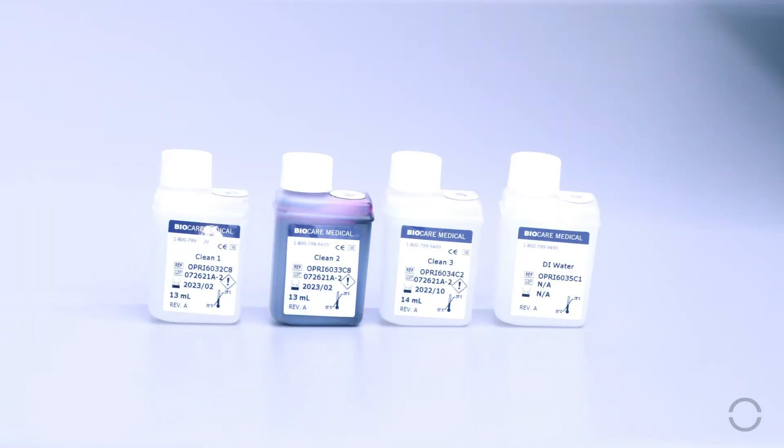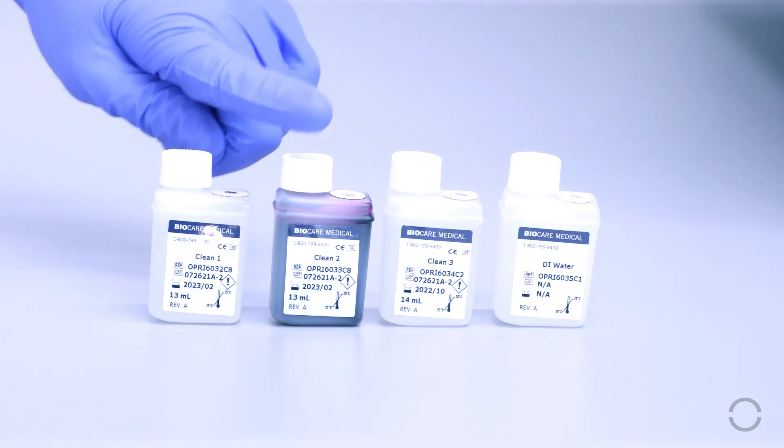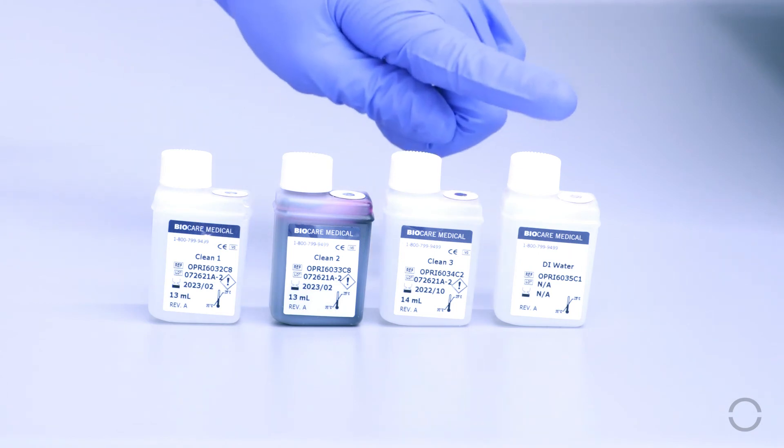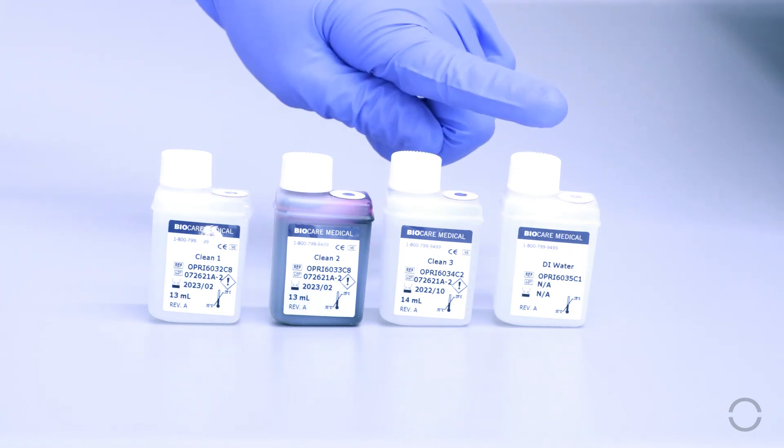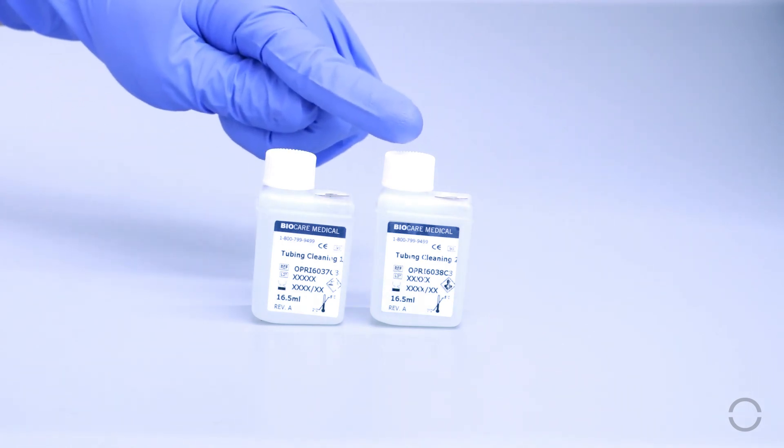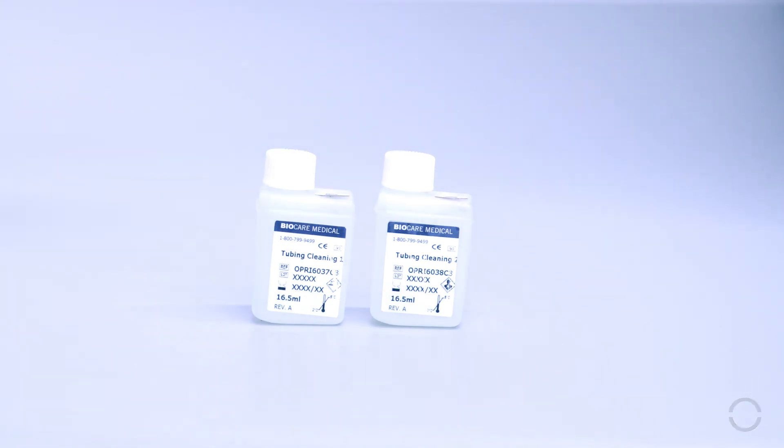The Encore Pro chamber cleaning kit consists of three solutions plus an empty DI water vial for removing DAB residue and cleaning instrument surfaces that may have contacted DAB chromogen. The tubing cleaning kit consists of two solutions for removing DAB and wax residues in the reagent and waste tubing.